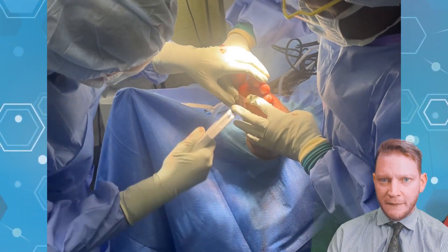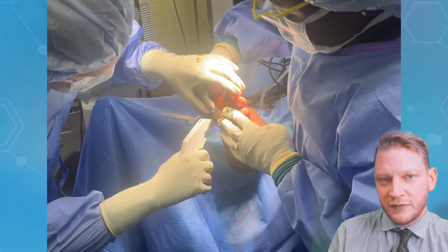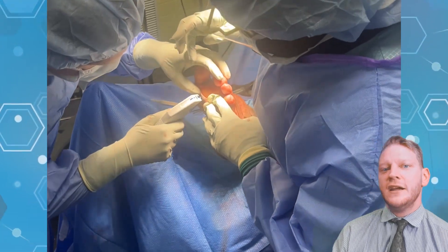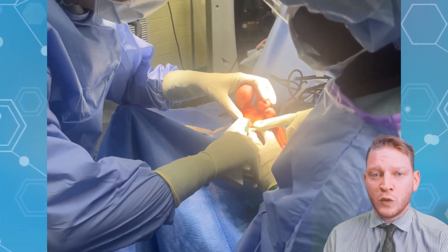You'll see here we're going to take the dressing off. We prep the patient in the operating room and use a live x-ray to make the cut. We apply a special graft on the plantar aspect of the foot at the wound.